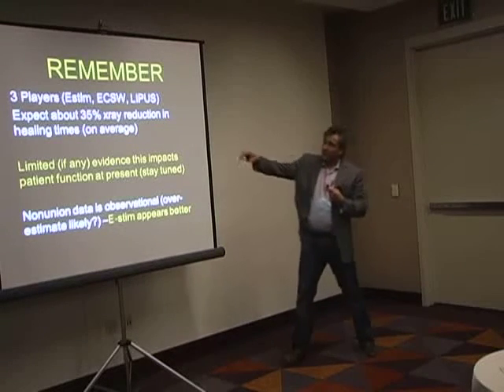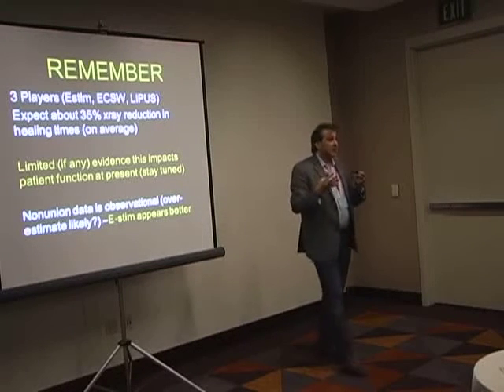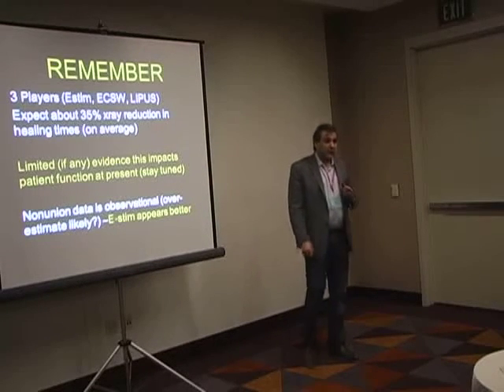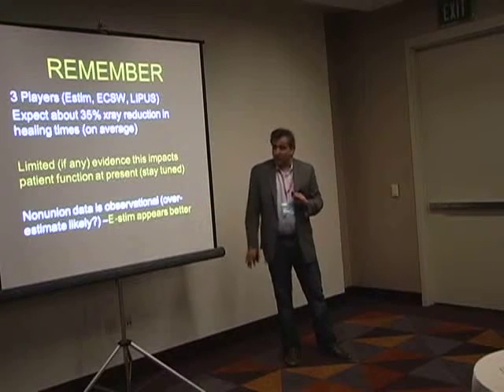So remember, there are about 3 players in the area. You can expect some benefit in radiographic healing. Remember that there is still limited, if any, evidence that this impacts patient function at present. And remember that non-union data is still observational. So in other words, it's likely an overestimate.